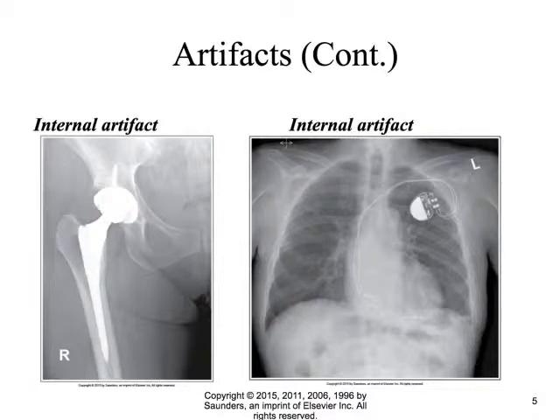Internal artifact. Now, these are not ones that we're going to try to remove. Sir, will you please remove your pacemaker so I can get a good chest x-ray. But any kind of hardware, orthopedic hardware, or any kind of device that's been installed will show up on the image.